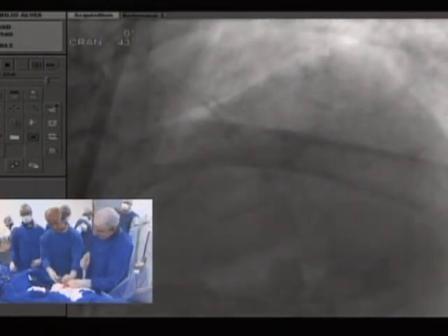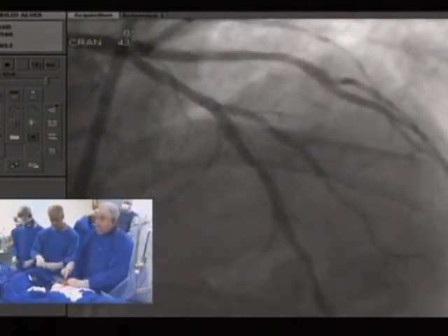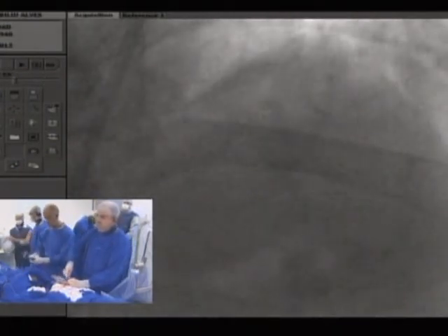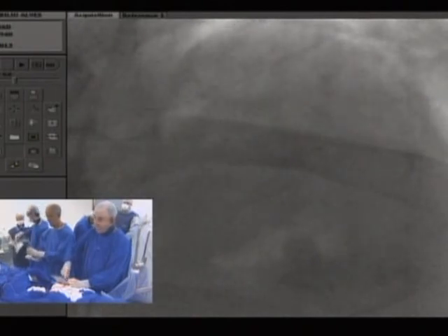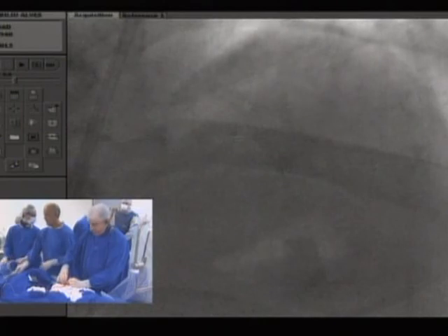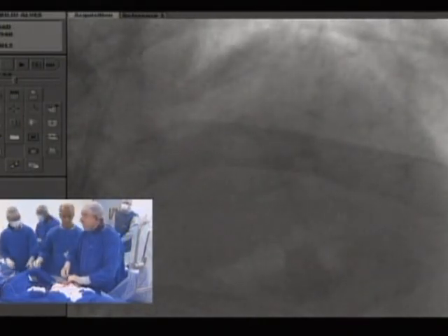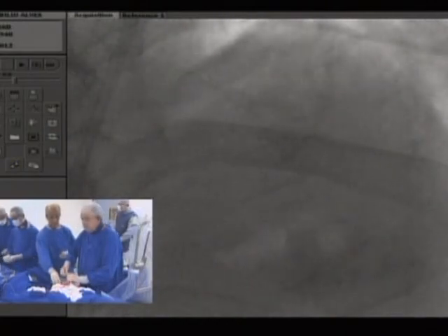Yeah. You know, after crush, we have to do a kissing balloon, no matter what it looks like by angiography. You have to do it anyway. So he's rewiring it now and then uses two balloons, right? And this is where I completely agree with Miguel. I think in bifurcations, it doesn't make any sense.